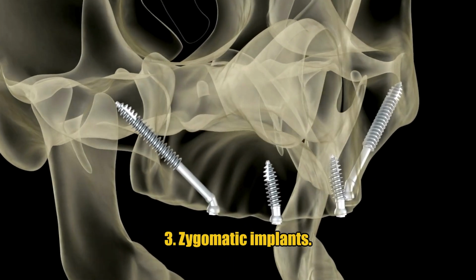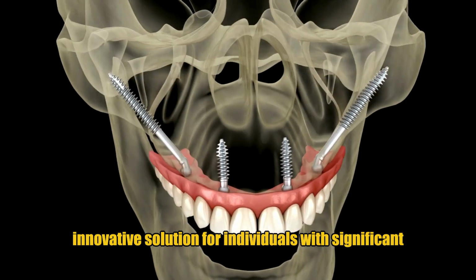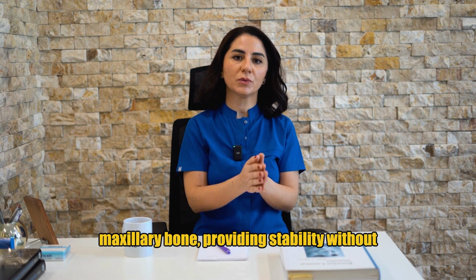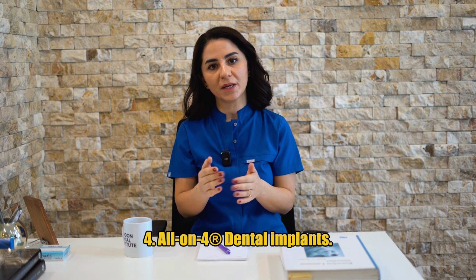3. Zygomatic implants. Zygomatic implants are less common but offer an innovative solution for individuals with significant bone loss in the upper jaw. These longer implants anchor into the cheekbone rather than the maxillary bone, providing stability without requiring extensive grafting procedures. 4. All-on-4 dental implants.